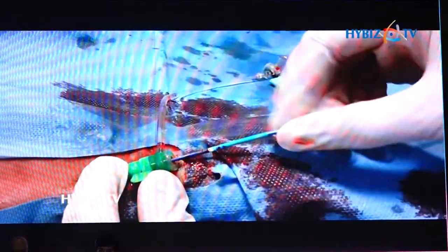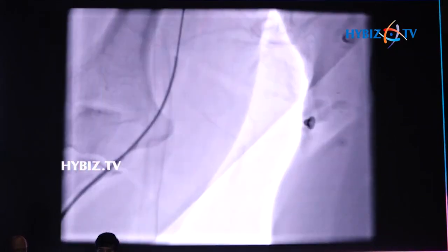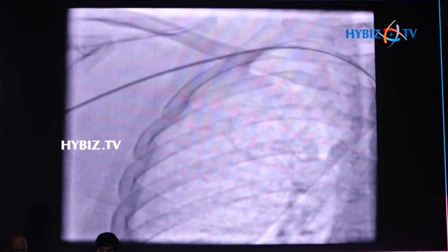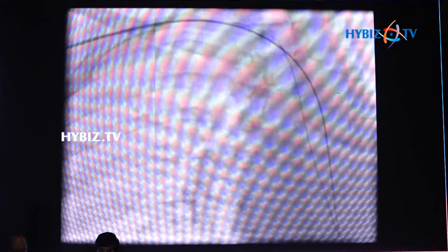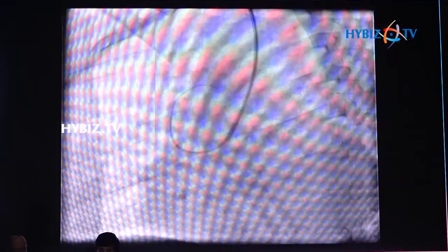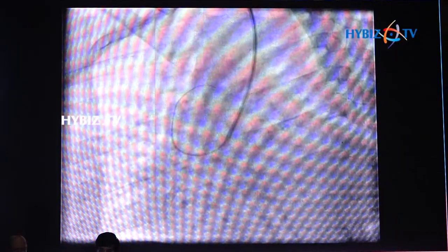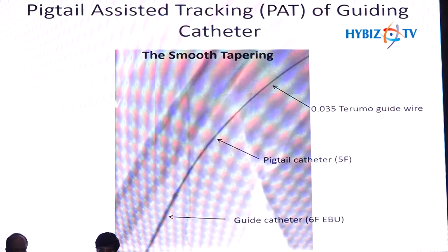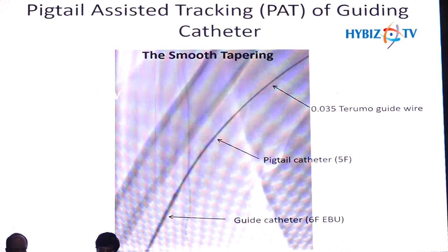This assembly went inside very easily. This was the real-time crossing of the radial loop using the pigtail and guide catheter assembly. It was negotiated easily through the subclavian artery and finally into the ascending aorta. The wire and pigtail were then taken out, and the angioplasty was completed.